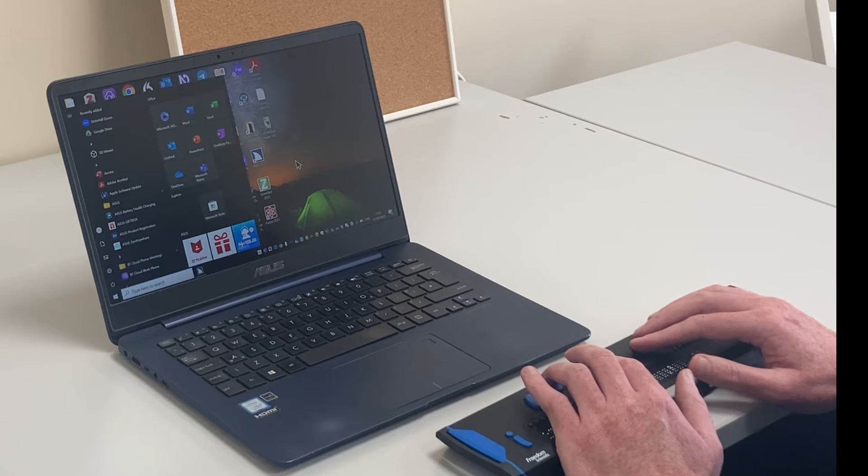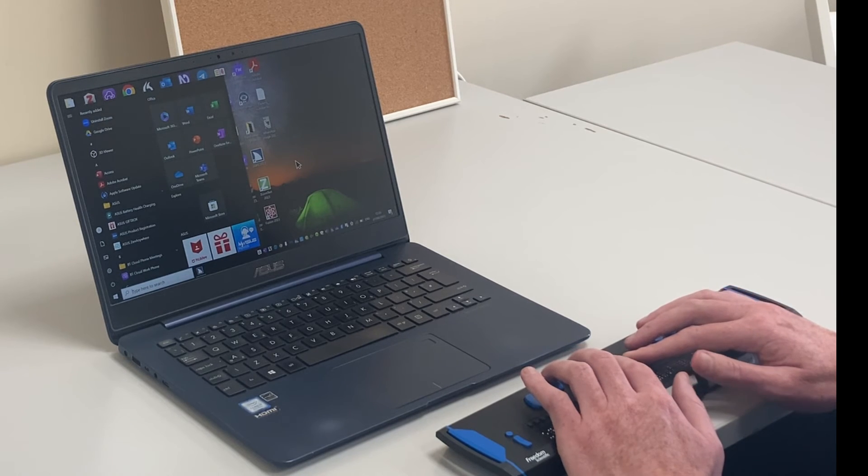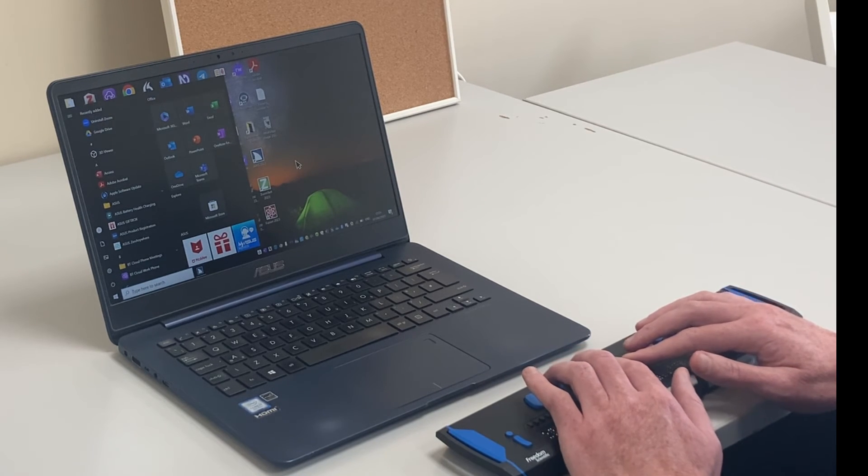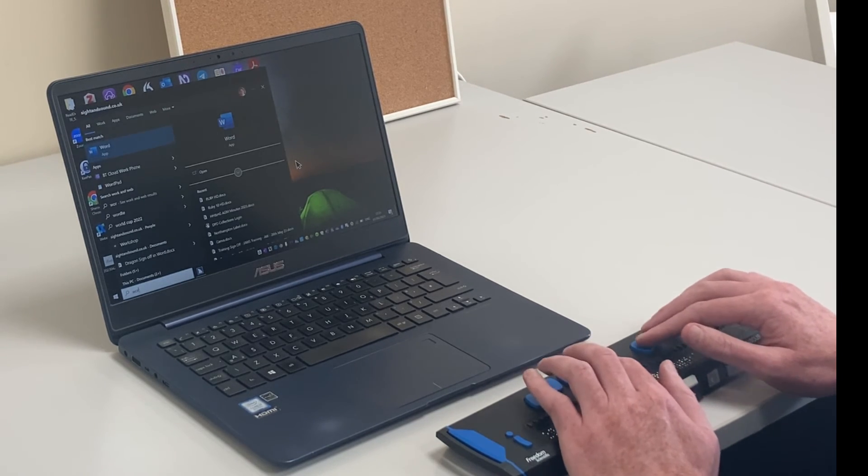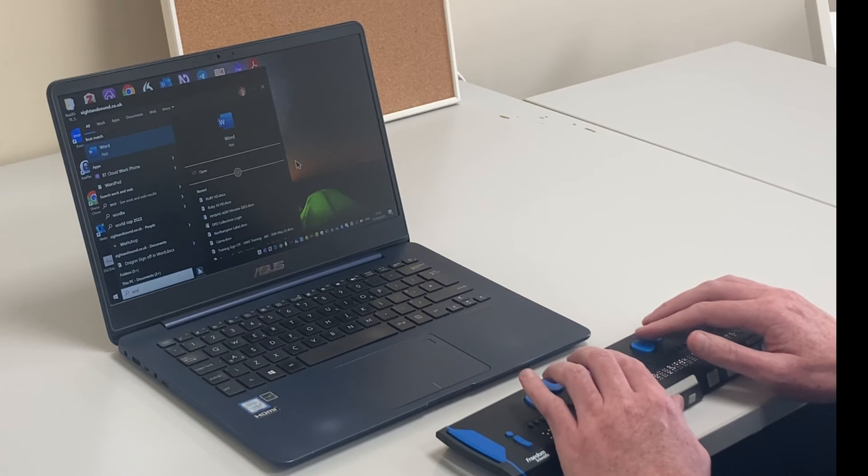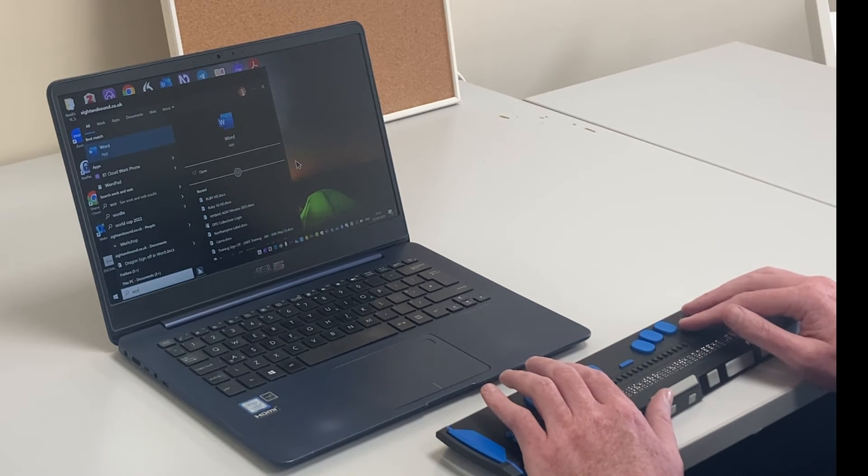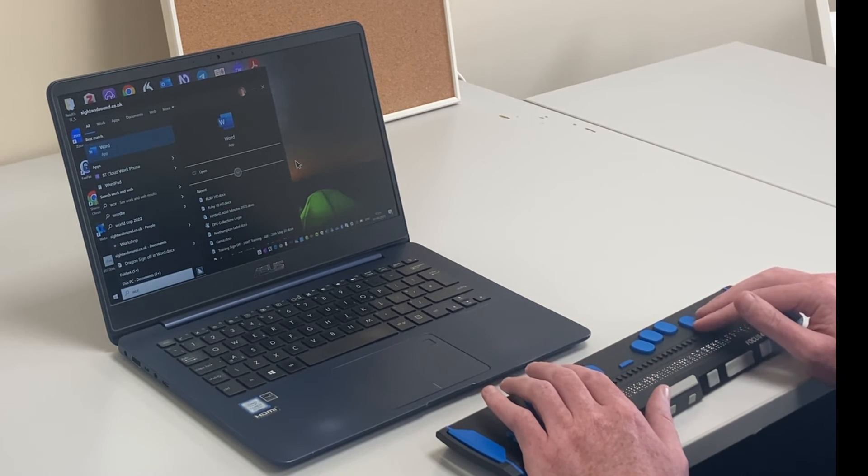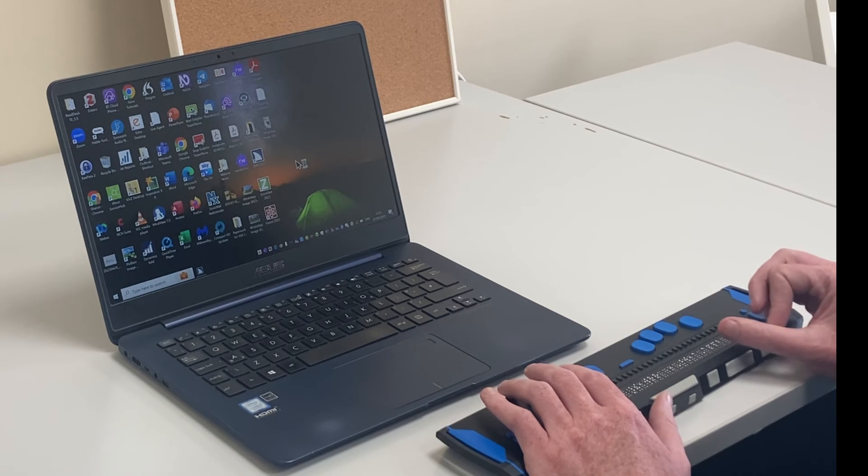Search box edit. Type in text. I'm now in my Windows start screen and I'll type in Word. Windows predicts my search and I'll press enter on the Braille display.